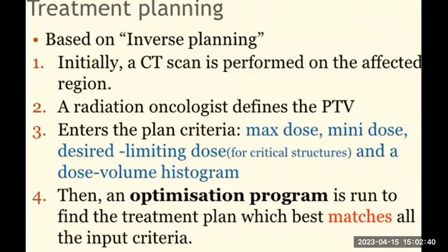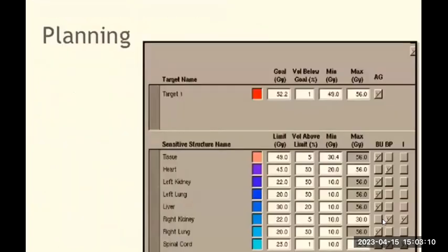If the tumor shape is very close to a regular shape, like spherical, it is very easy, and you can confirm the PTV. But if it is not a regular structure, then the dose level has to be properly distributed. Distribution means there is a tumor, and at which place what dose level is applied. That has to be done.